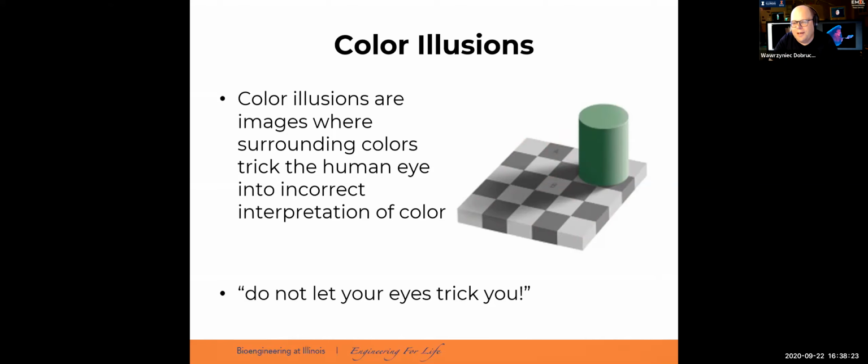You can test it yourself using an image processing system. A and B are exactly the same color, but why does B look whiter? Because it's compared to the shadow right around over here, the shadow which the cylinder gives.